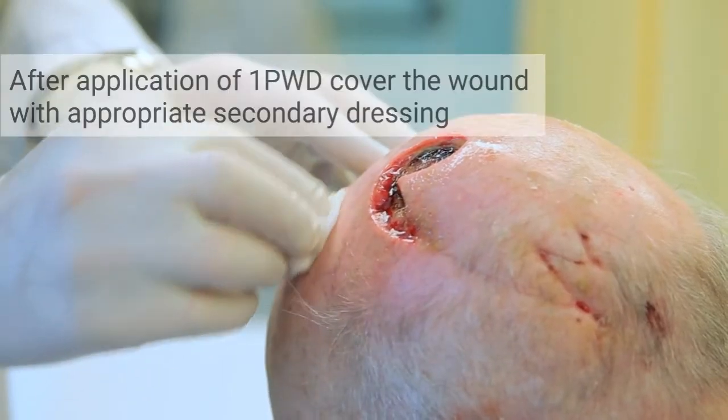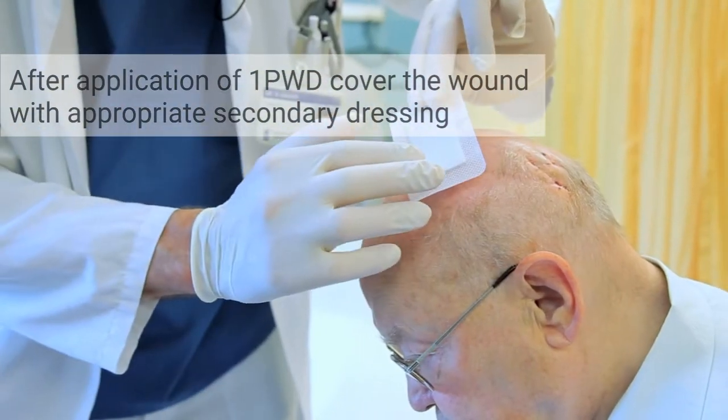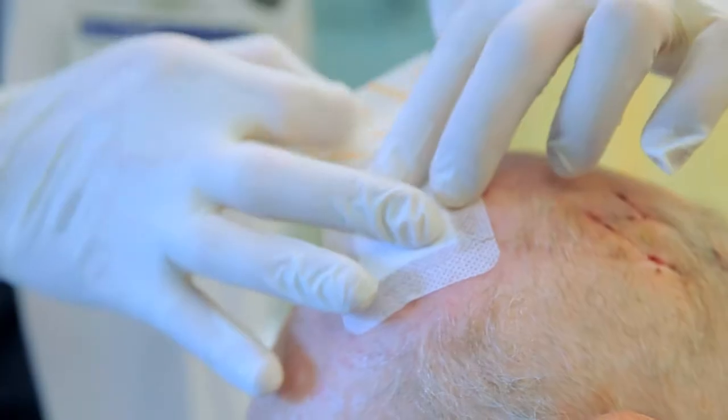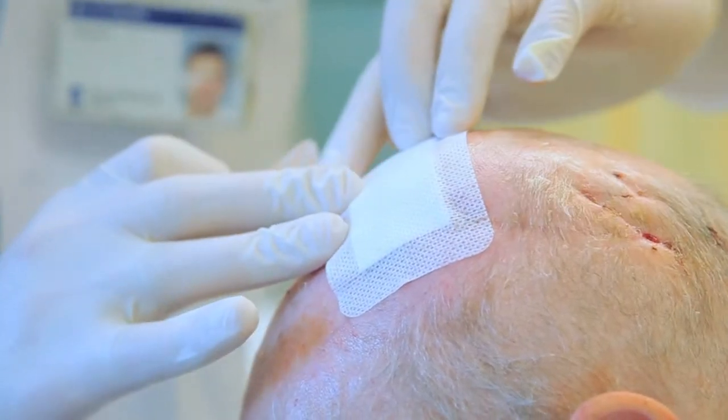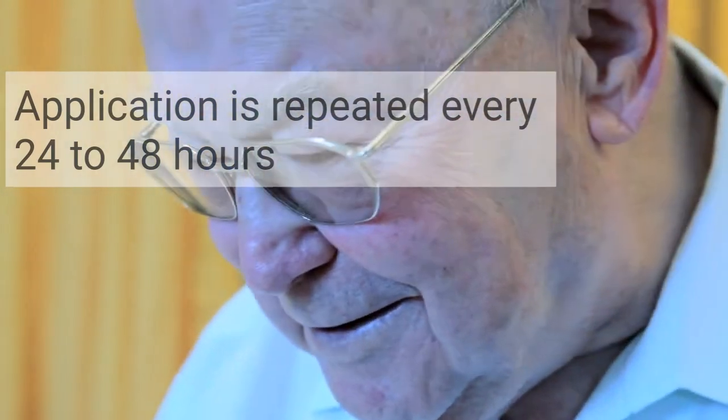After application of One, cover the wound with an appropriate secondary dressing. The recommended dressing is a non-woven gauze or an absorber that is adjusted to the wound exudate. The application is repeated every 24 to 48 hours.